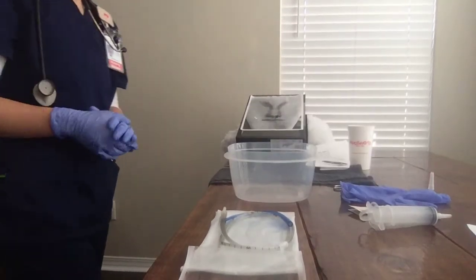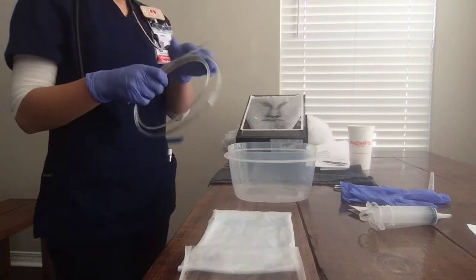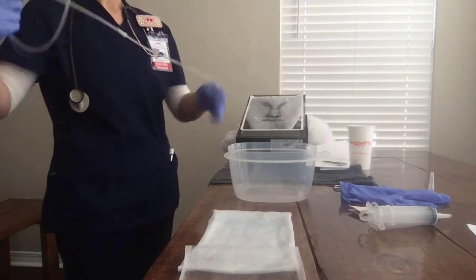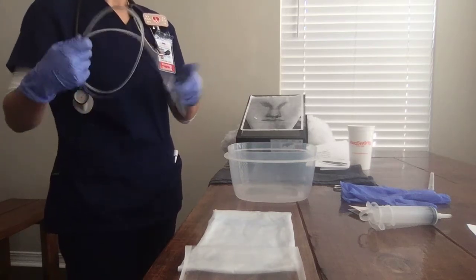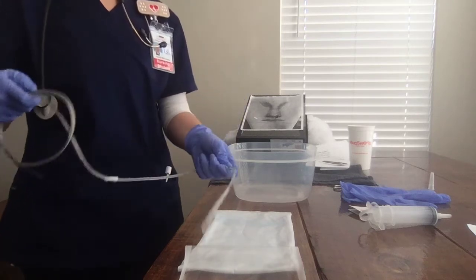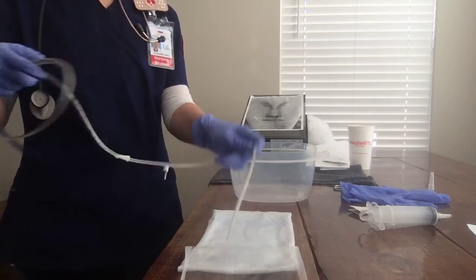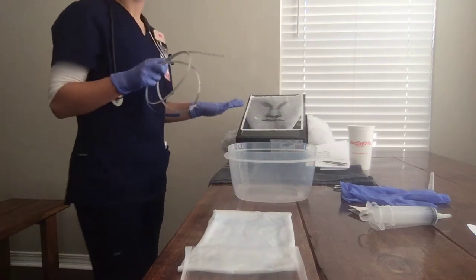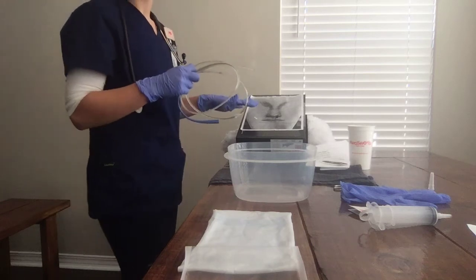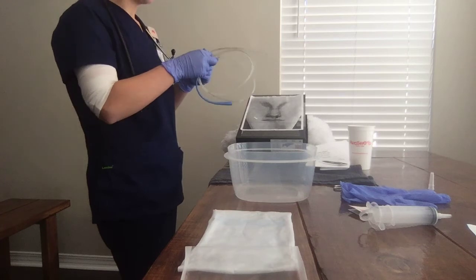And so now that I already have everything set up, I would coil the end of this tube in my hand and then release. And then I would lubricate the 4 inches with the water-soluble lubricant that I have on here. And then I would instruct the patient to extend his head against the pillow, and I will insert gently and slowly until I get to the nasopharynx.